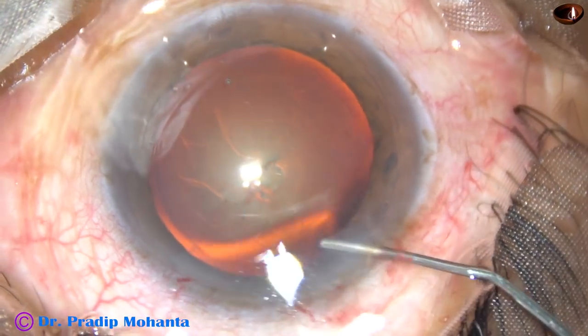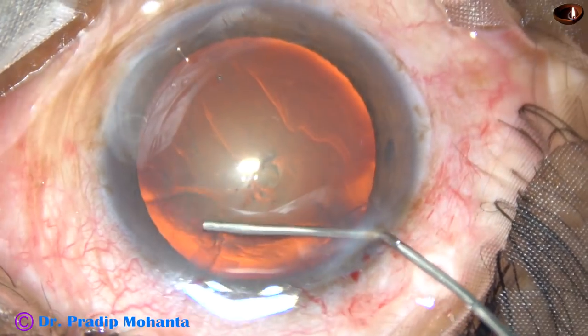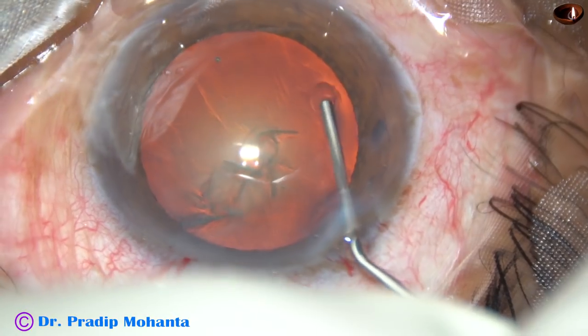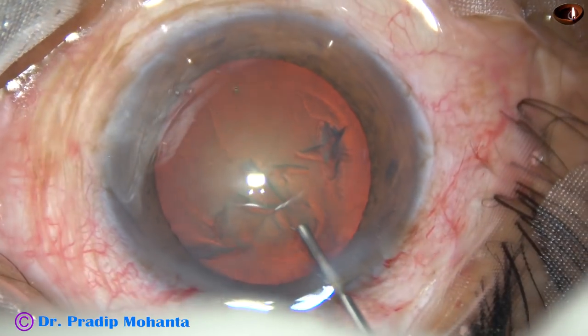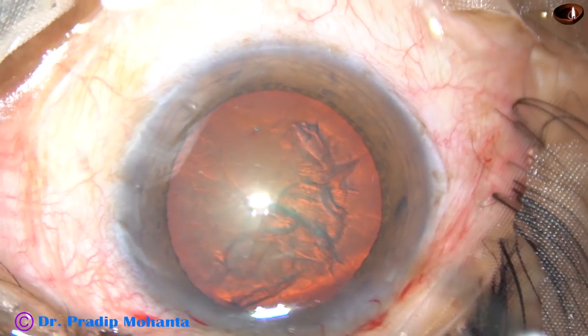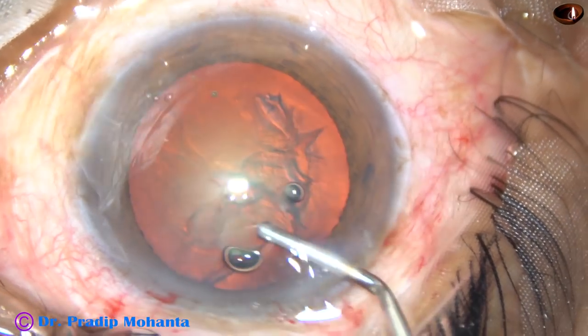Now, hydrodissection. Fluid wave is passed just underneath the anterior capsular rim. Hydrodelineation was attempted, but in this case the golden ring didn't form. The nucleus is mobilized.